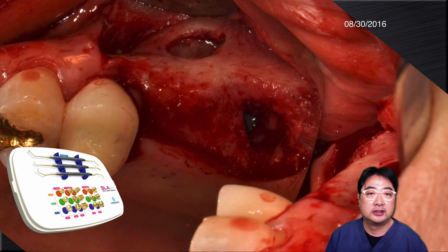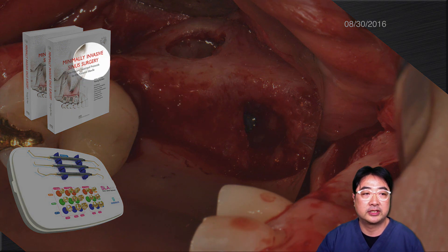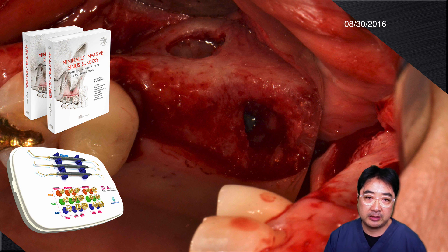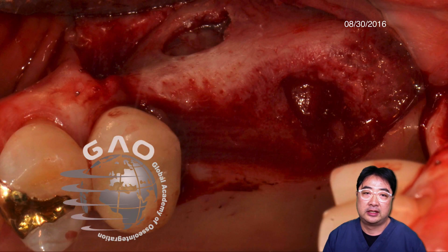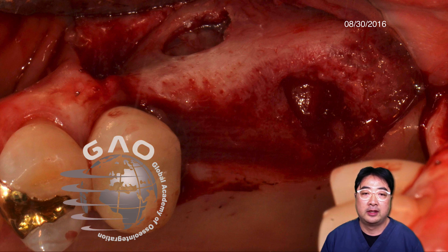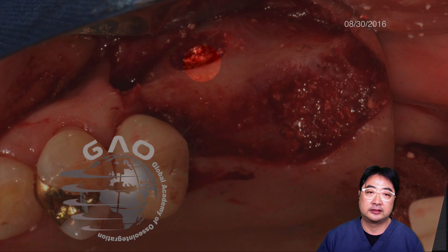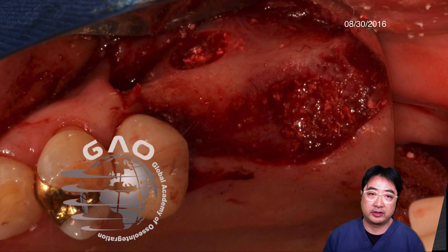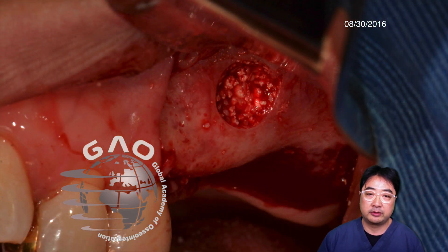For this procedure, I made the window with the SLA instrument, which is my favorite. This technique is very well described in the textbook as minimally invasive sinus surgery — I keep saying I'll have another clip to explain how to use this instrument. After that, I placed the collagen tape over the perforated area, covering it very carefully. Then I placed bone graft from the crest and the lateral wall at the same time — simultaneous bone graft from the crest and lateral. This is the clinical picture from the lateral after filling the bone.